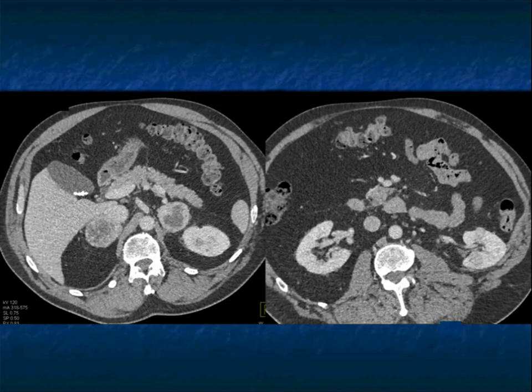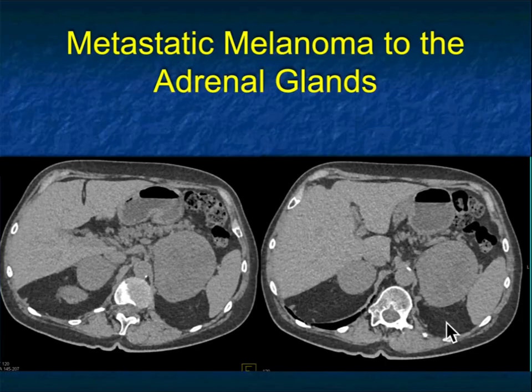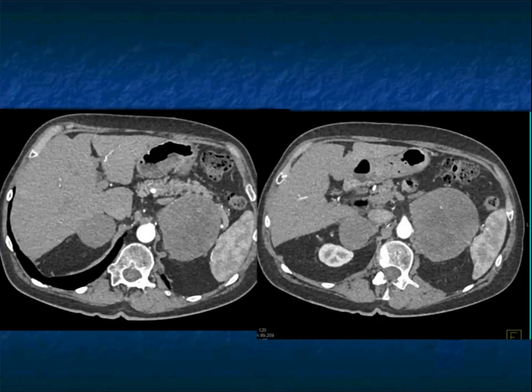As you go from arterial to venous, the lesions wash out. The central necrosis is still there, but the masses are solid. Another case with bilateral masses, though asymmetric — the left one is particularly large. When you give contrast, you can see the lesions really don't enhance to any great degree.